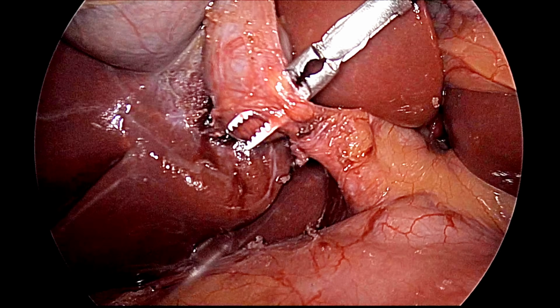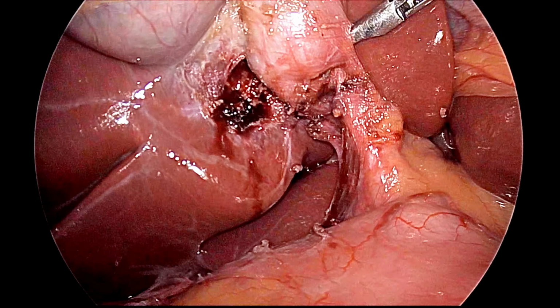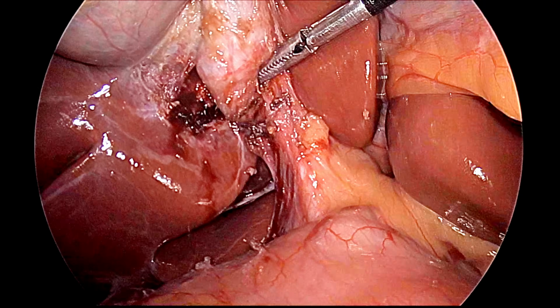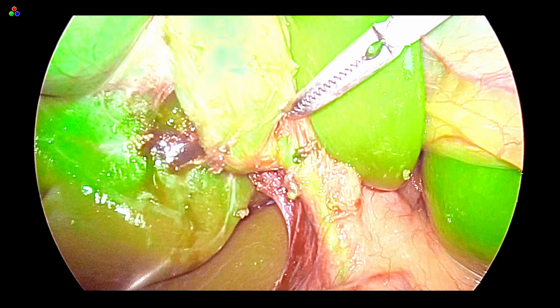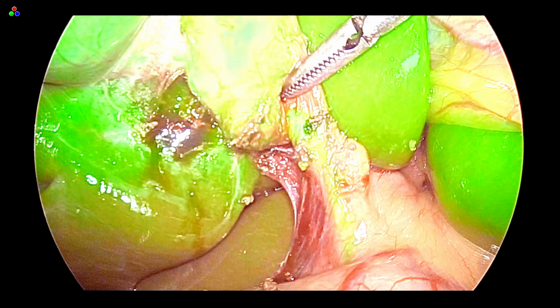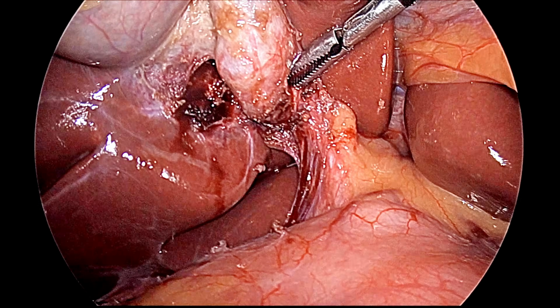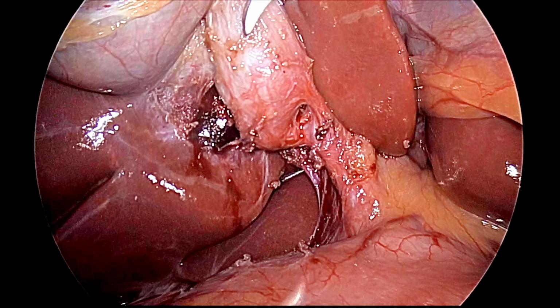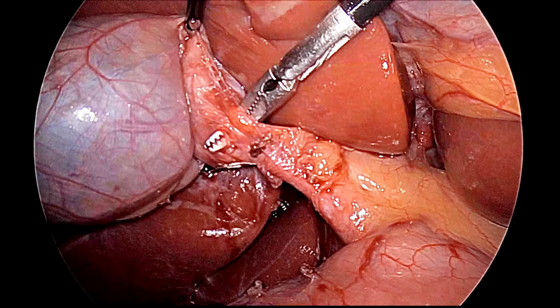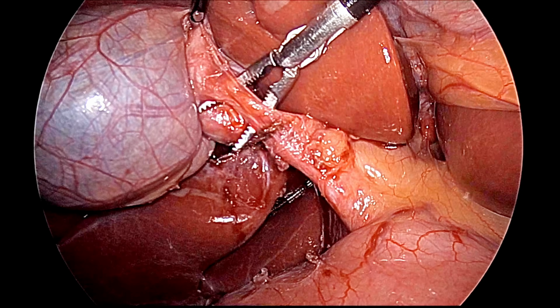And a window is being created between the artery and duct. This is the ICG mode, and we can see the short cystic duct. Behind is the duct. And now this is the artery. So this is the anterior window, and the critical view of safety should be established.